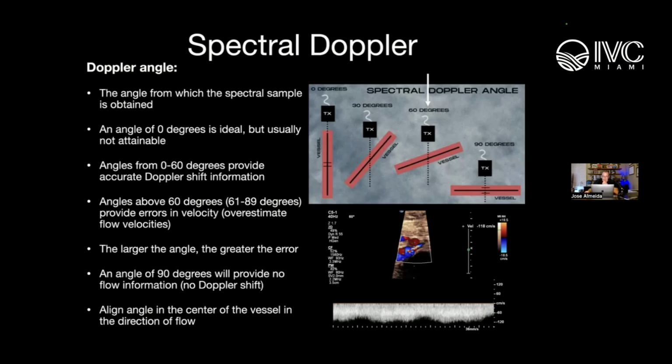there's actually a ton on this slide, on the Doppler image. Number one is a curvilinear probe. So where is the transducer? It's a little different because in this case there's a color shift away from the midline. So you have to know how to interpret flow direction with the curvilinear probe, which is a little different than what you described with a linear probe. You're still using the color bar as a guide as to flow toward or away from the probe.